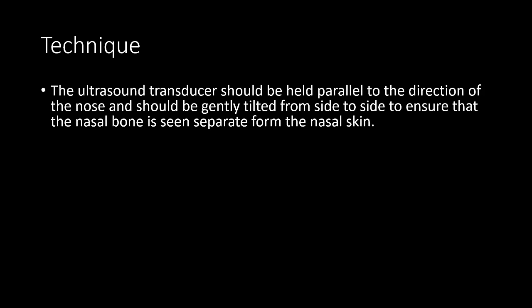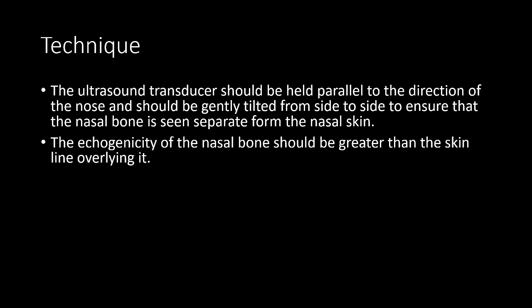Technique. The ultrasound transducer should be held parallel to the direction of the nose and should be gently tilted from side to side to ensure that the nasal bone is seen separate from the nasal skin. The echogenicity of the nasal bone should be greater than the skin line overlying it.